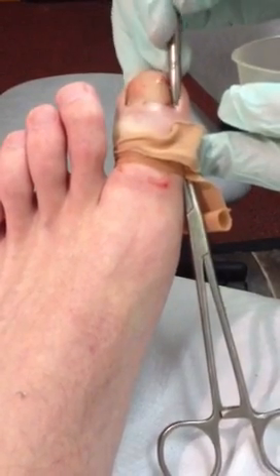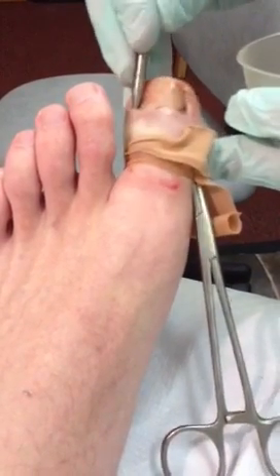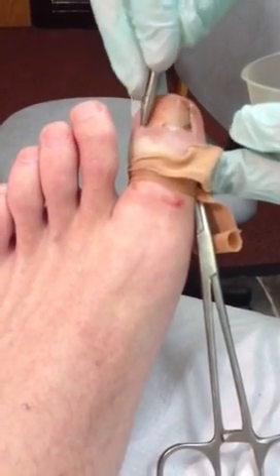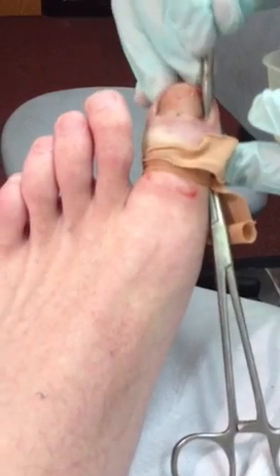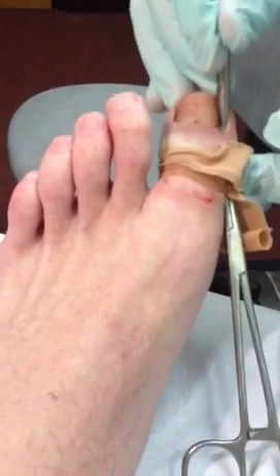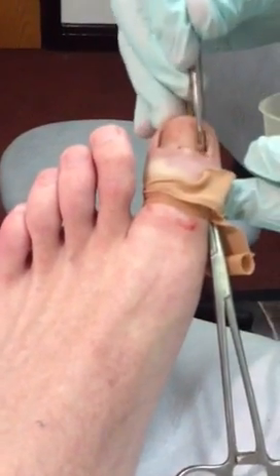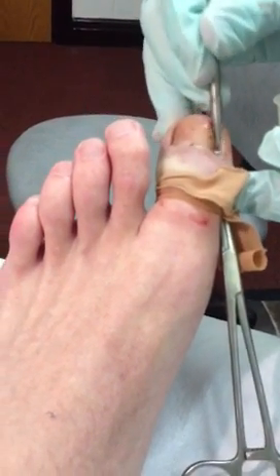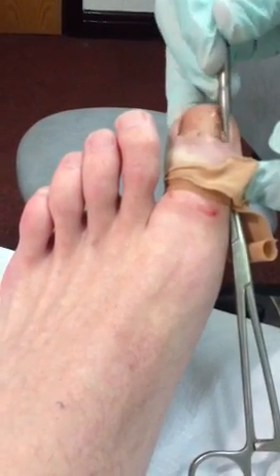I work it in because I do not want this nail ever, ever to grow back — either side. How toxic is that to the skin? It'll probably take a week longer to heal than if we didn't put it on. But if we didn't put it on, the nail would grow back and you'd have the problem back again. It just kills the bit of skin cells around it. This is a bit of a strong acid, and you might get a little bit of discharge in about seven days' time — but that's normal, because we've put this stuff on your toe.